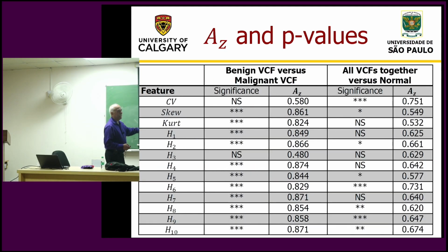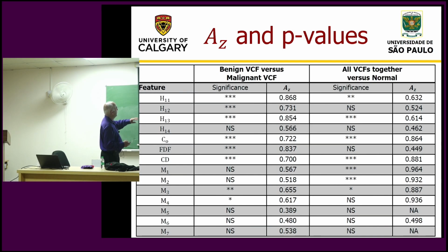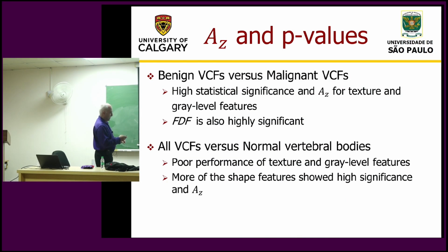So we got a lot of these tables for all of the features, and I won't go through all the numbers. Let me go to some of the summary. Those numbers are there, you have a PDF file of this also.